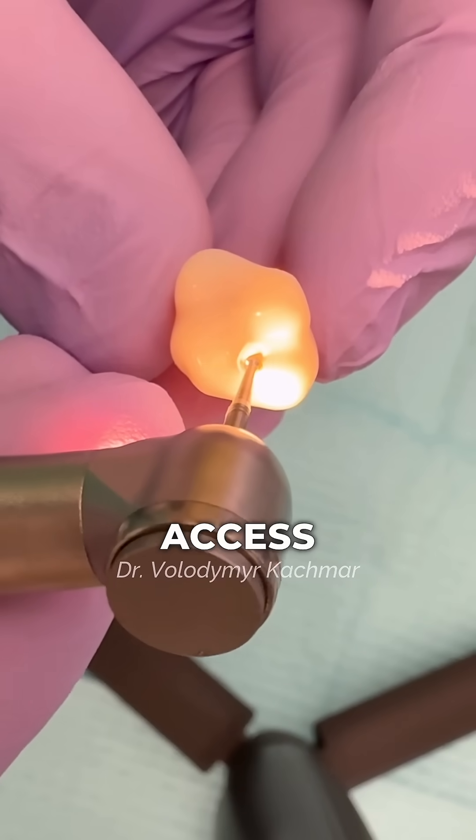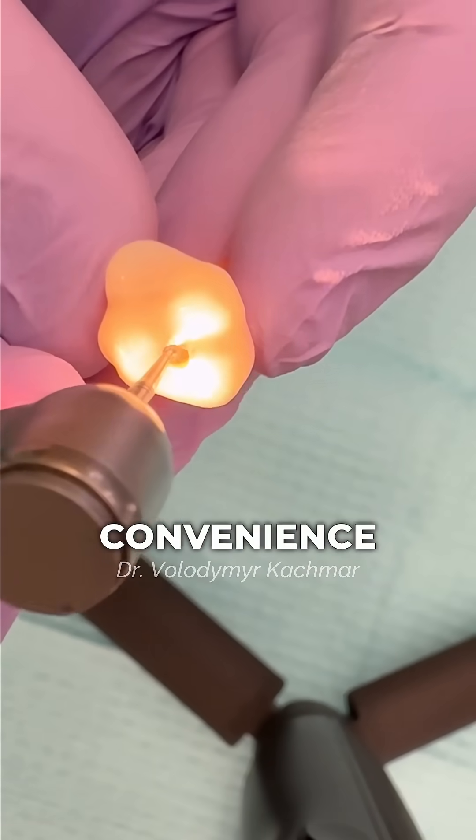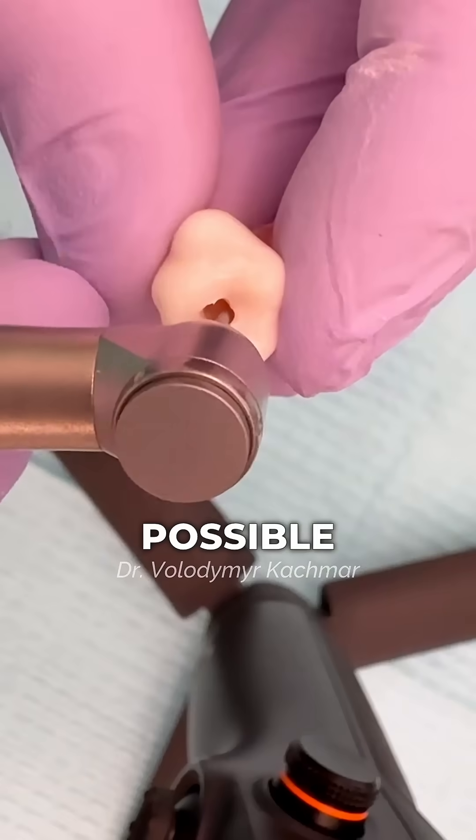First, create a perfect access. This step is crucial for convenience and preserving as much healthy structure as possible.